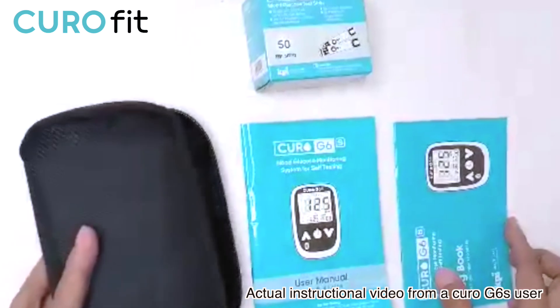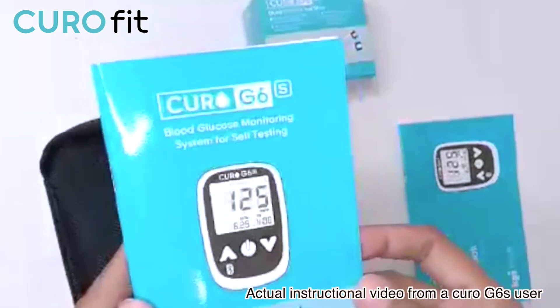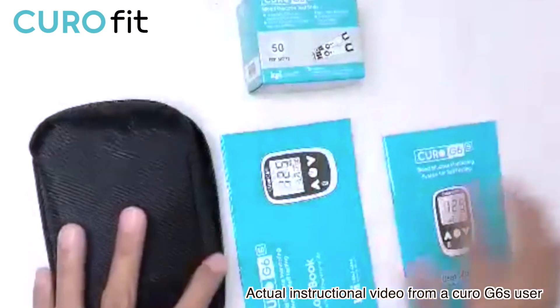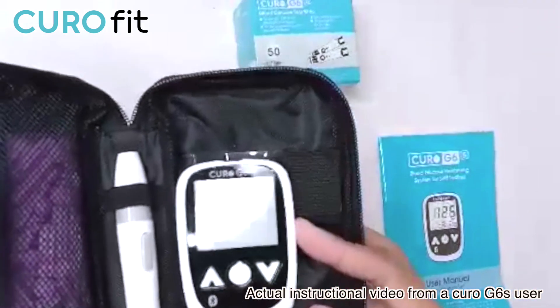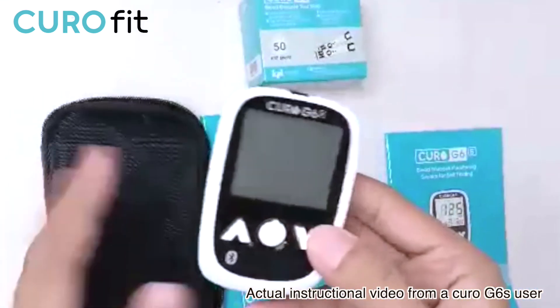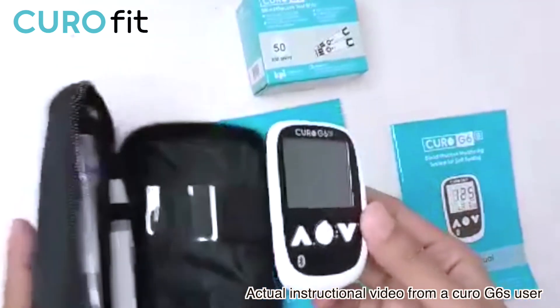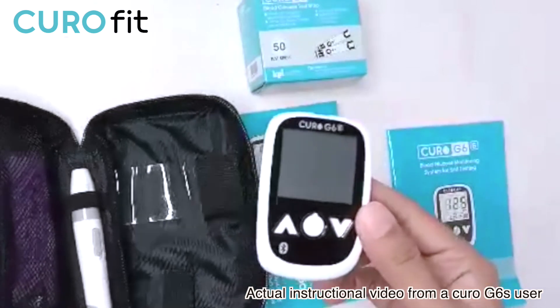It also comes with 50 lancets, a portable storage case, user manual, and a logbook in case you wanted to keep track of your blood sugar. This device can also record up to 365 readings, and you can connect it with your phone via Bluetooth through the TeloMD app, available for download on iOS and Android phones.